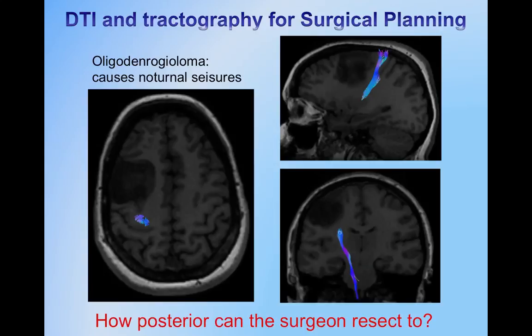And the problem is, the way that we've performed this imaging is a weird surrogate measure where we've followed water, and there are lots of thresholds and cut-offs we put into it, which means I could change one of these arbitrary thresholds and make this tract as big or as small as I like. So we don't have an absolute idea of what we can tell the surgeon about how far he can cut back. It's one of the biggest problems: we create these images, and I don't know if you've ever seen any of this tractography, but it's really difficult to faithfully say this is where the edge of the tract is, this is exactly where the surgeon can cut to.